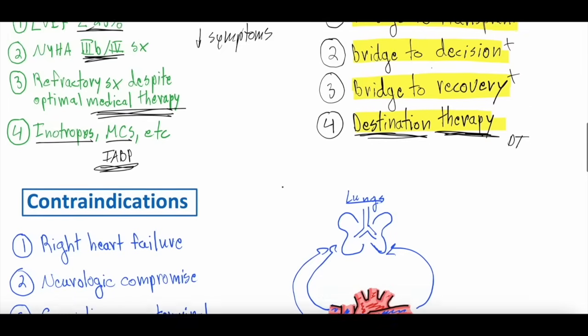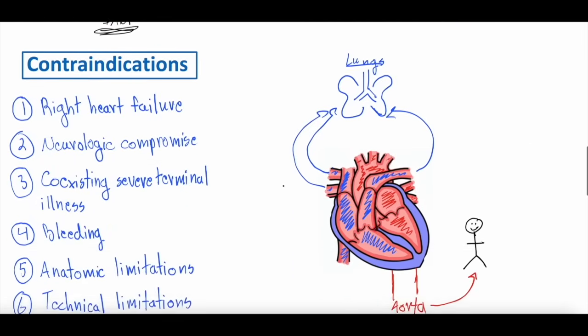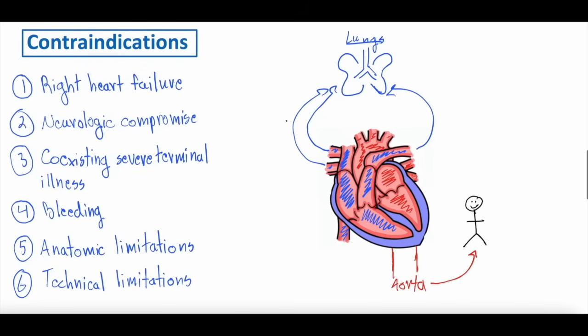All right, are there contraindications? Are there patients who can't get an LVAD? Well, some of these contraindications are what we call kind of hard or absolute, and some are kind of soft contraindications. One is right heart failure.